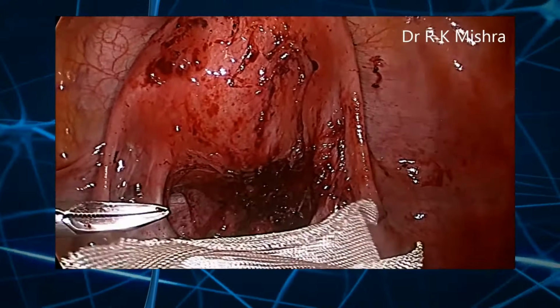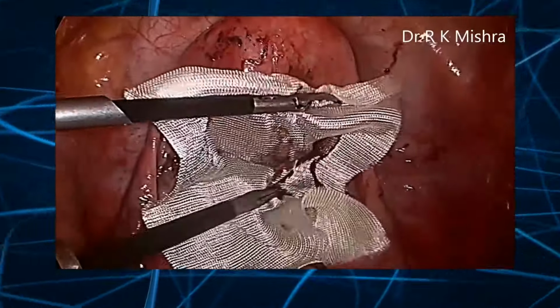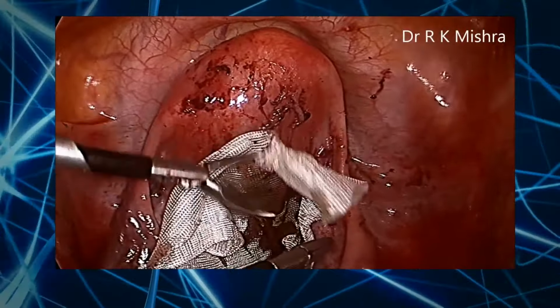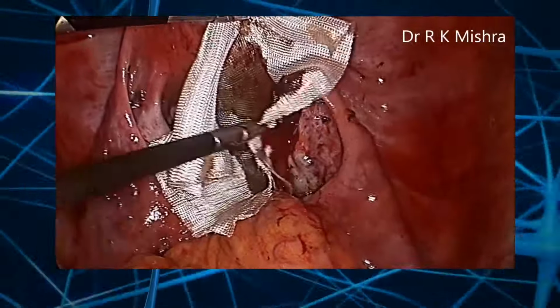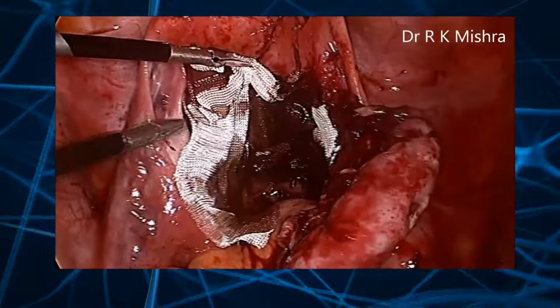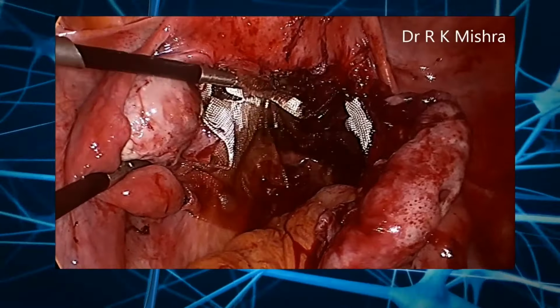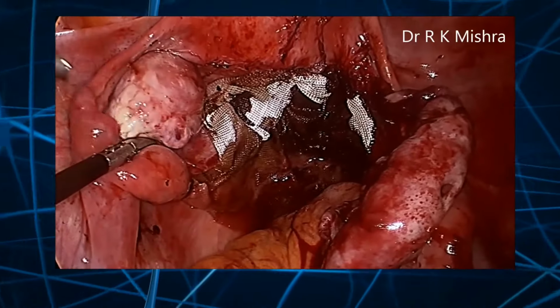This is Interceed. You can spread it in dry state, then it is better. It should not become wet. That day you have seen that it became wet while we were introducing. So, it breaks if it is wet, and always take care that the ovary should be pulled up and it should go into the ovarian fossa. Both the ovaries should be lifted if you are using Interceed, so that this ovary will not get adhered. So, it is lifted up.